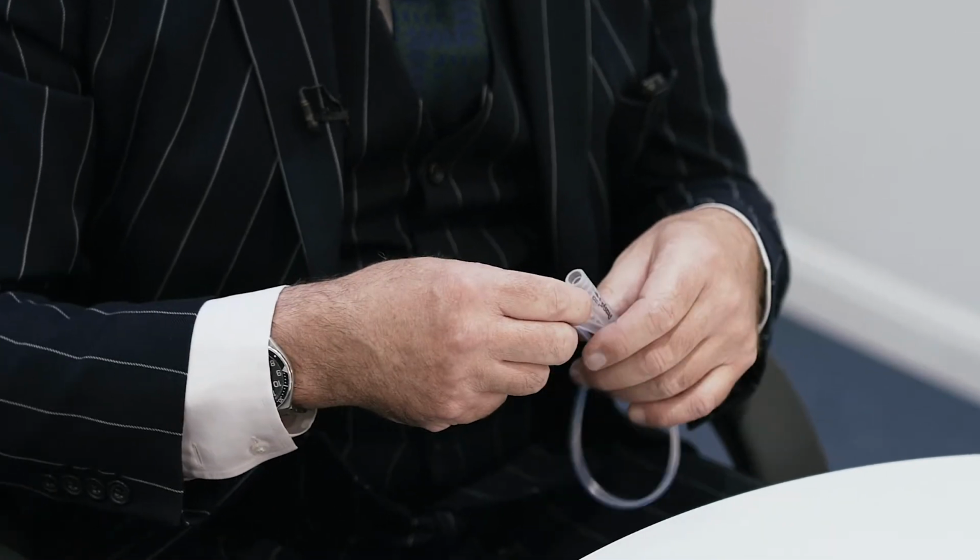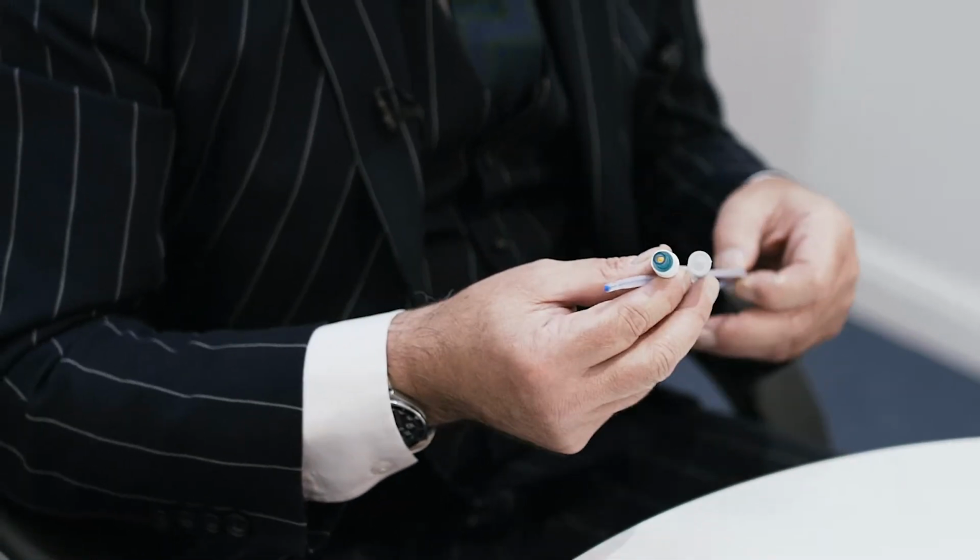So, in order to address the problem, there's a rather novel device which is very clever in the sense that it's simple: it's an ultrasound device that creates vibration along the catheter, which is not felt by the patient. And this disrupts the build-up of the biofilm. By doing this, it reduces the opportunity and the nidus for bacterial colonization and therefore the risk of urinary tract infection, but also enhances the ability of the antibiotics, if an infection does occur, to work more effectively. Hence a lower dose, and because infections are less frequent, it is less likely to develop antibiotic resistance over time by the constant use of different antibiotics.